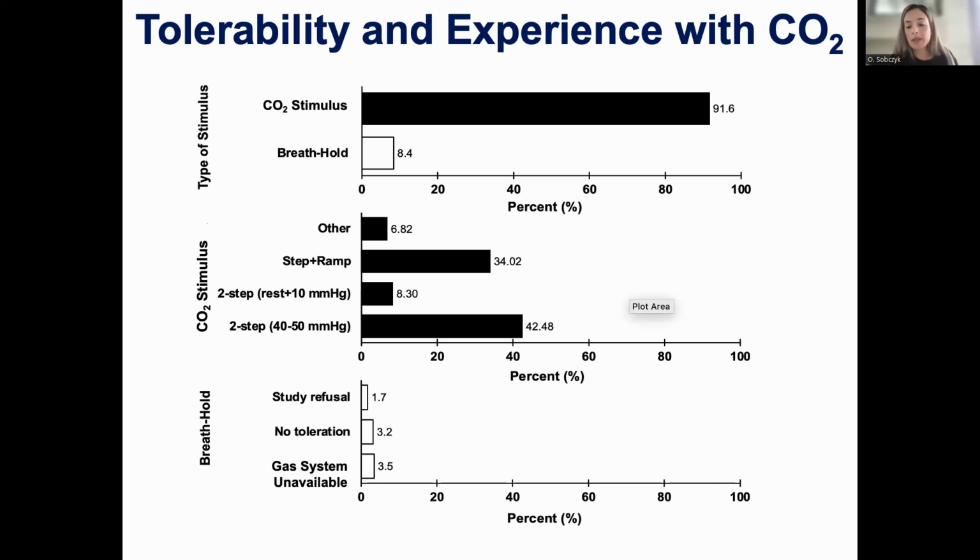So 1.7% just flat out refused to participate in a CVR study at all. 3.5% underwent a breath hold as our gas delivery system was unavailable. And finally, one of the most interesting data points is 3.2% couldn't tolerate the CO2. That's pretty good.